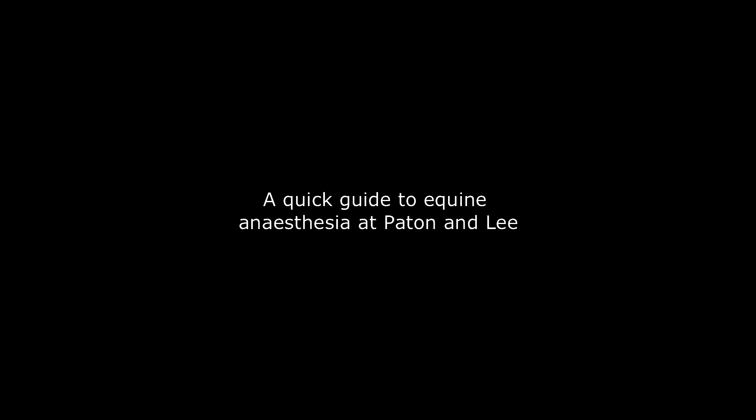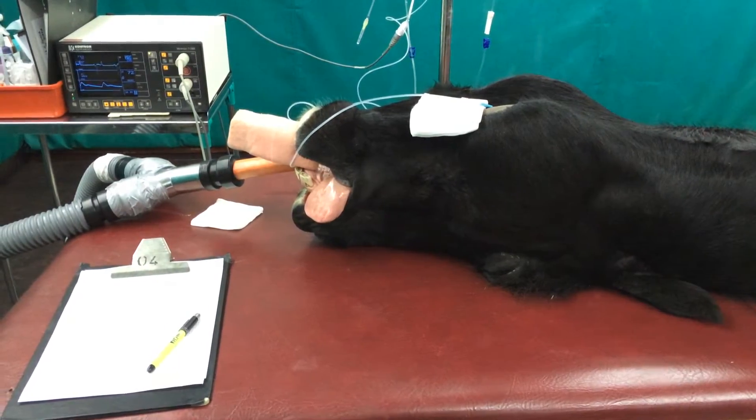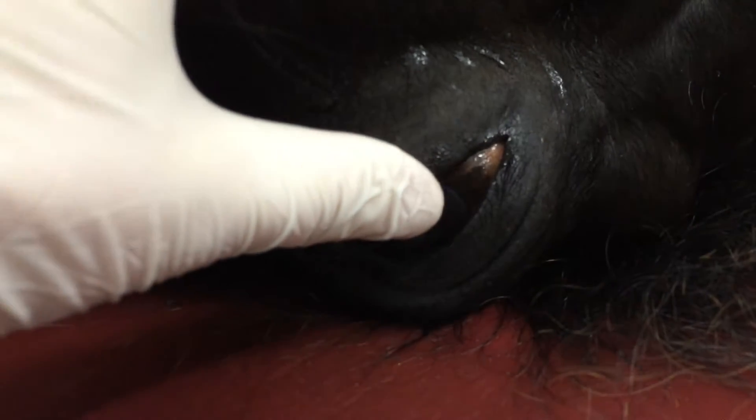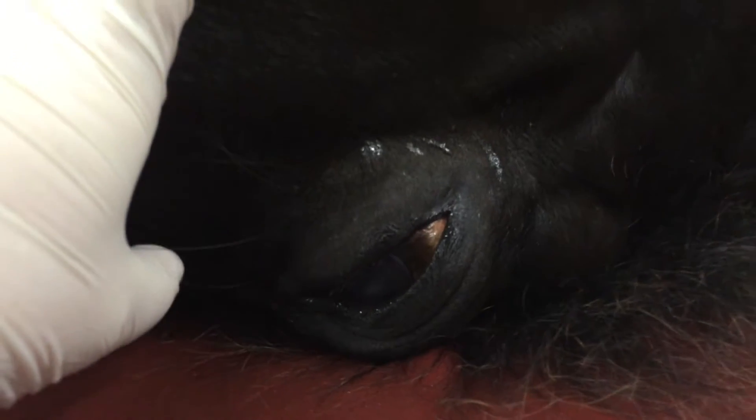I just wanted to do a brief run through anaesthesia at Peyton & Lee. Here we have a horse anaesthetised on the table and one thing we can do is closely monitor the position of the eye to gauge the depth of anaesthesia. You can see that this horse's eye has rolled downwards and inwards towards the corner and there's a slow blink reflex there. So that's a good level of anaesthesia and I'll show you the other eye in a moment.